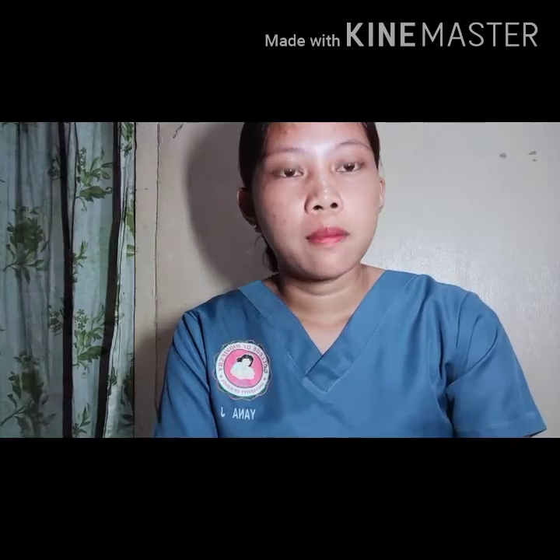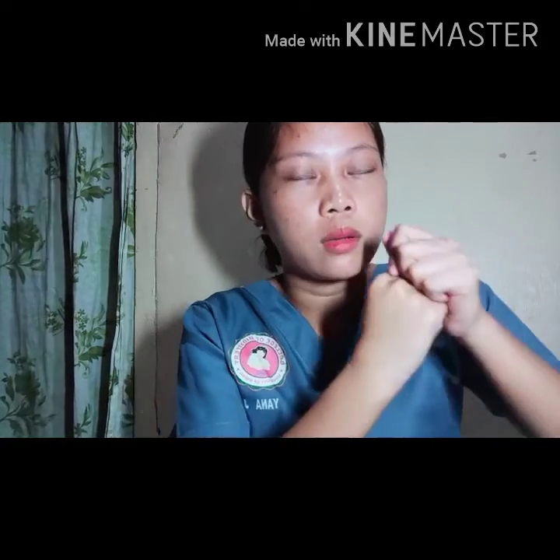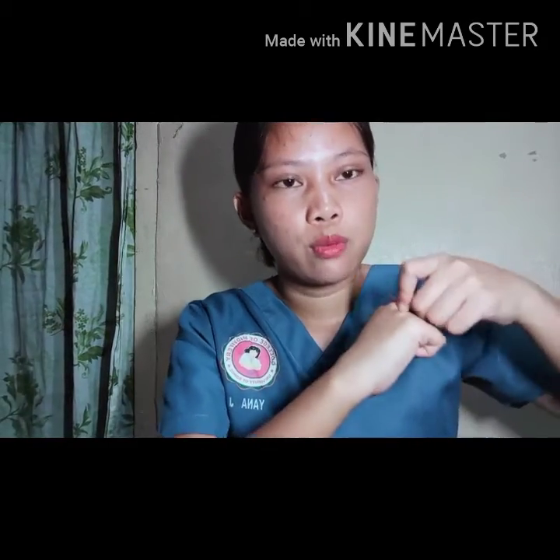So next is remove the protective cap from the distal end of tubing. So i-remove to nimo protective cap naman, protective cap from the distal end of tubing. Remove nimo, hold it ready to attach to the catheter, maintaining the sterility to an end. So dito nimo tugunitan tong ihang tumoy nga mo i-attach sa catheter kaya ro maintain ang sterility.